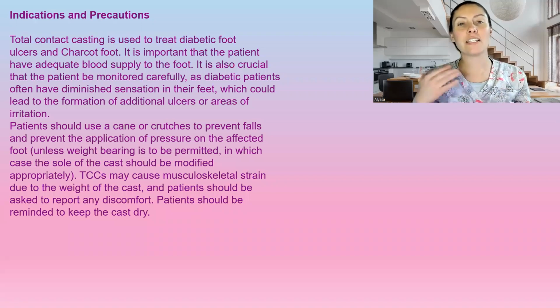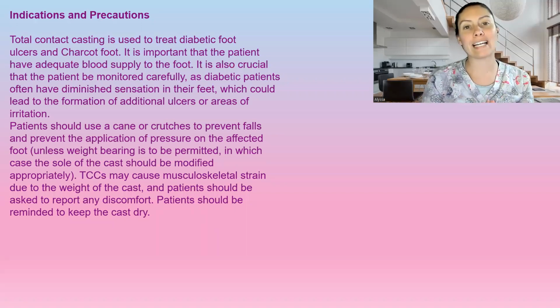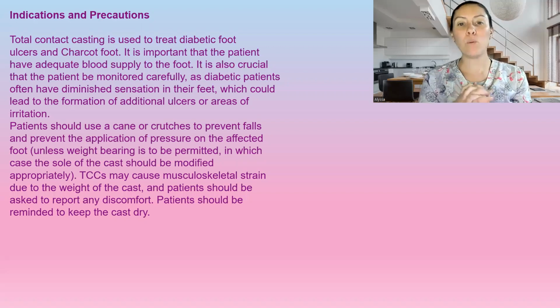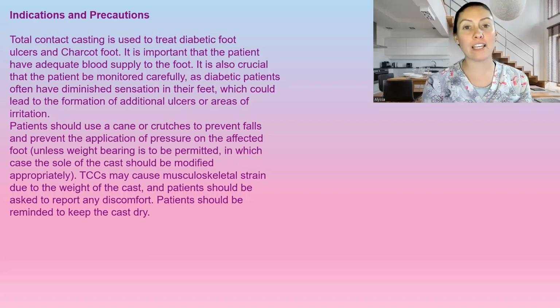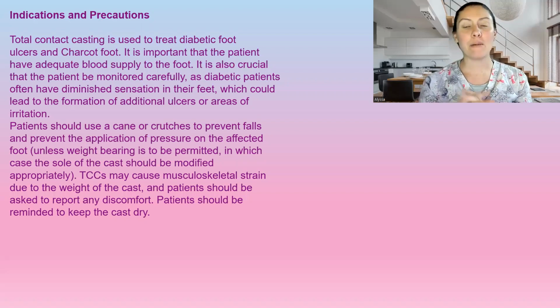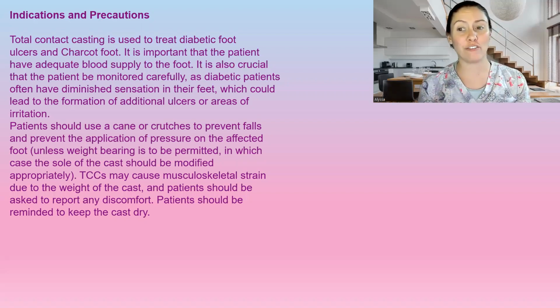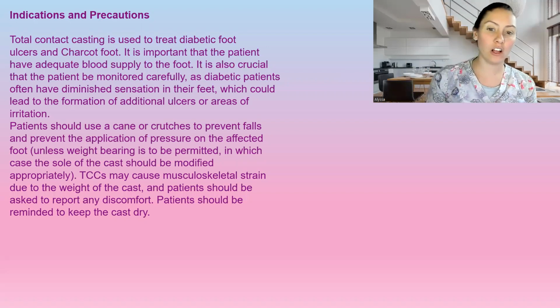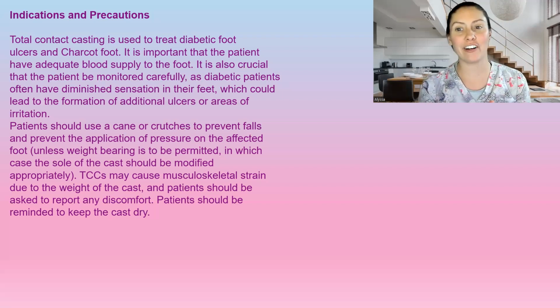So, indications and precautions. Total contact casting is used to treat ulcers and Charcot foot, okay? It is important that the patients have adequate blood flow, okay? So we have to make sure that we're checking the blood flow of the foot before we ever apply this, because diabetic patients often have diminished sensation in their feet, so it can lead to the formation of ulcers and irritation in other areas, okay?